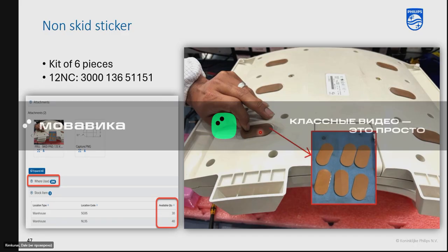Remember I showed you that it's easier to browse, so you can put in the 12NC or the name of the coil, find the coil, and you'll have the whole list of all the FRUs that are available for that coil, instead of wondering whether it does or having to search specifically for it.